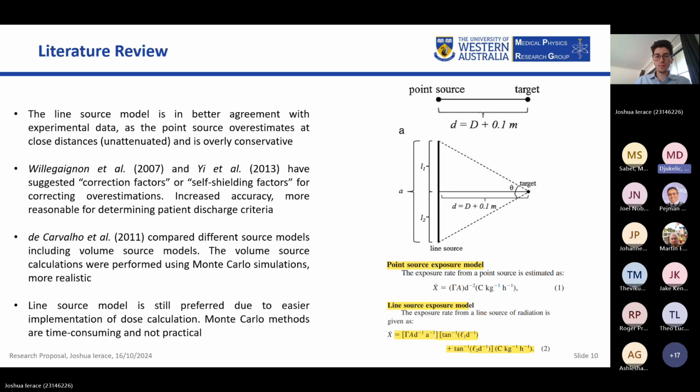And the second thing is NUMEX does provide advice to the physicist and to the staff. When you use the software and type in all the parameters, you get a number, yes, but it also exports a PDF with tailored advice for a certain situation, depending on which target audience you have, whether it's a carer, patients, physicists, and so on. But obviously, as Josh said correctly, this still has to be interpreted by the physicist to make a good call.